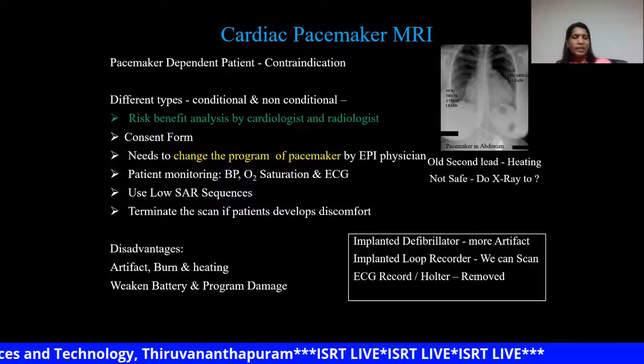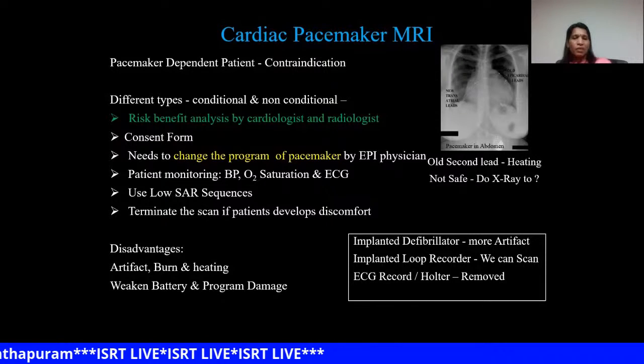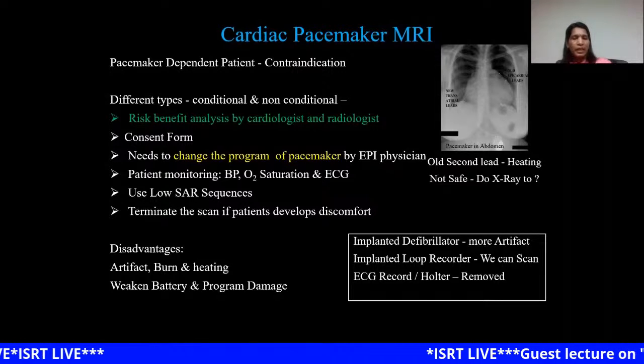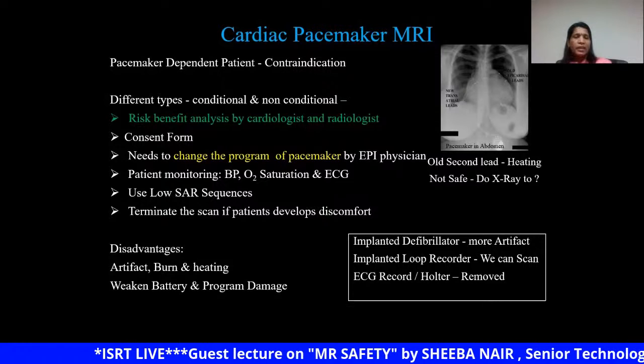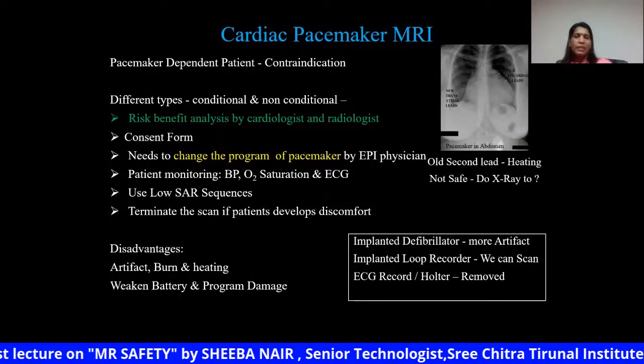And we have to get a high-risk consent form, and the EP physician should change the program of the pacemaker. It should be done pre-procedure, and after the procedure it has to be reprogrammed, and the patient should be monitored throughout the examination.